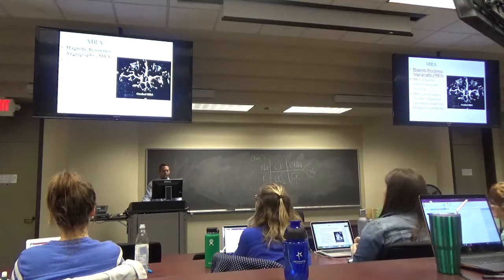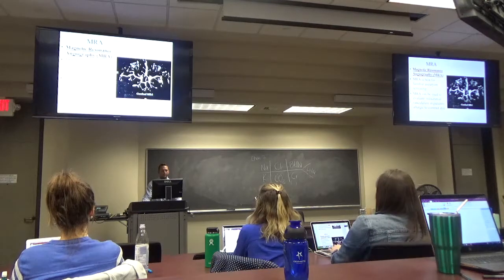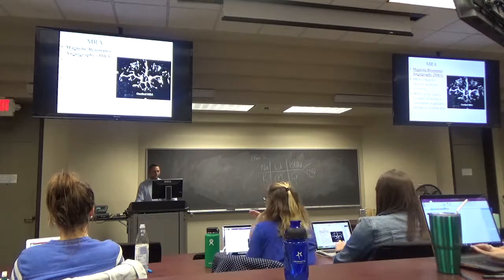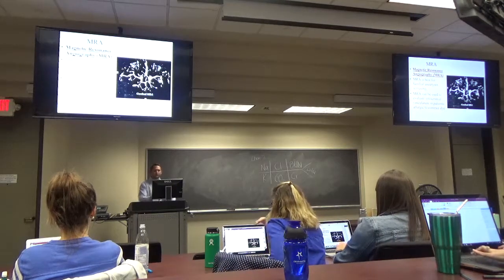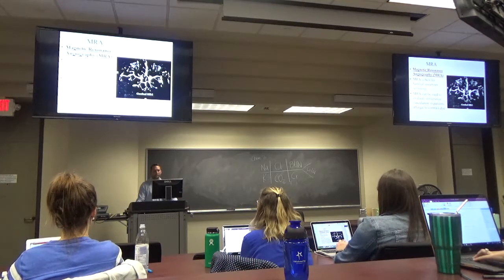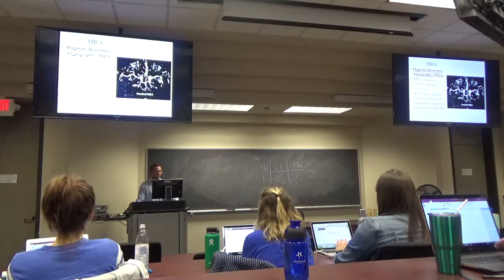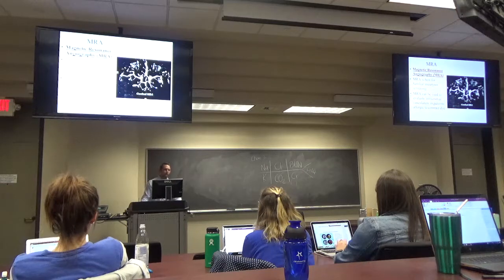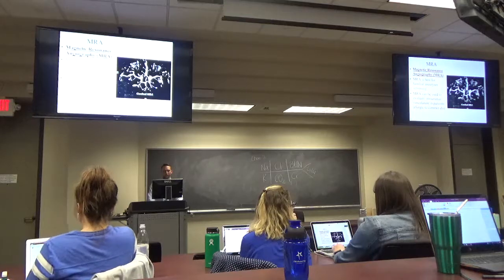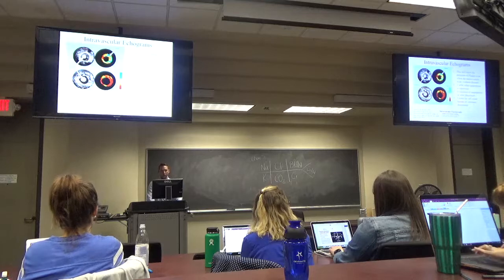So there's also magnetic resonance angiography. If you're looking for an aneurysm, this is showing a cerebral MRA right here. You have the carotids coming up, the middle cerebral arteries, the anterior segment, posterior segment. So if you want to evaluate for aneurysms, like berry aneurysms in the anterior communicating arteries, for instance, which is a common spot, then you might do this.